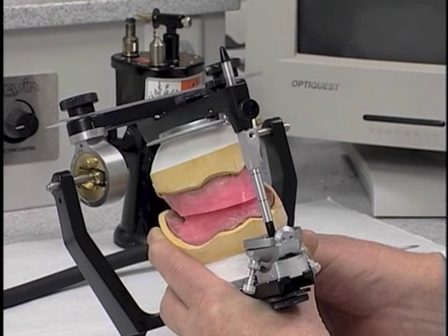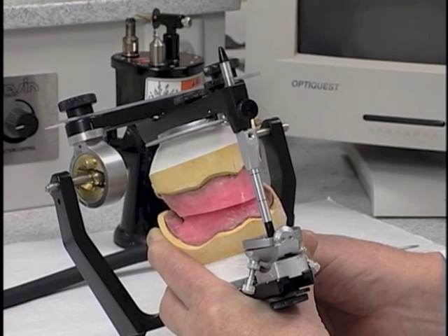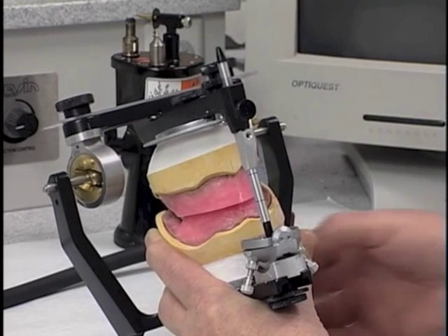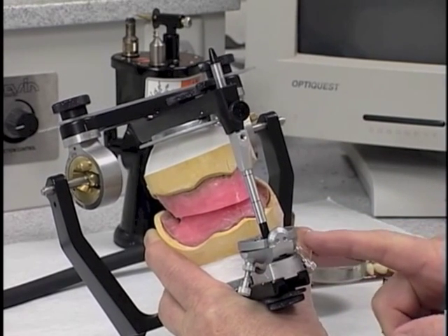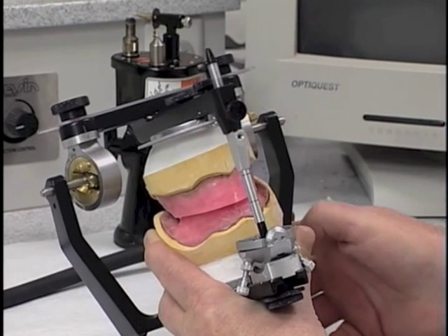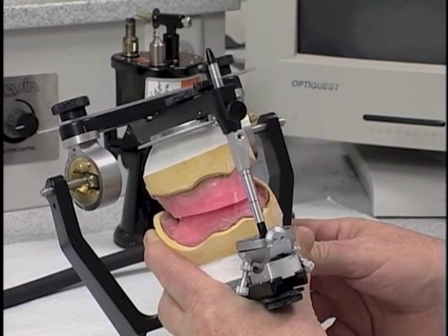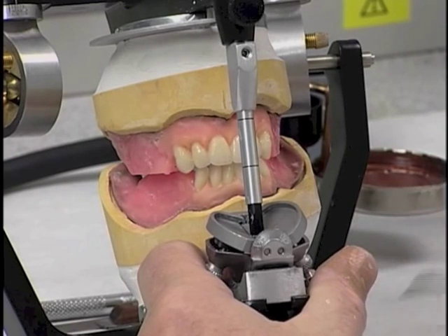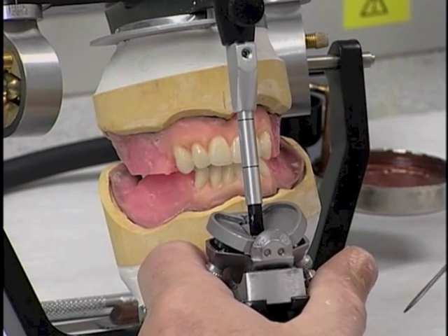Then in arranging the mandibular anterior teeth, we will arrange those with a fair amount of vertical overlap to them, and after they're arranged to a point that we think they are very aesthetically acceptable, then we will use the condylar or the incisal table and adjust that in such a way that it protects the anterior teeth as we're arranging the posterior teeth. We've now arranged the 12 anterior teeth into what we consider a nice aesthetic arrangement.